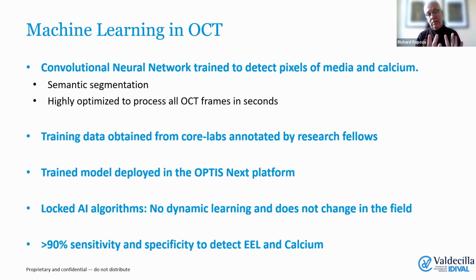This not only involved the AI effort in and of itself and the algorithm that comes out of that, but also optimizing the way we compute all these things so that you don't sit there waiting 10 or 20 seconds for the answer. It comes up in literally 1, 2 or 3 seconds on the screen. Otherwise, the user experience is not good enough. No matter how good the technology is, you can't be sitting there waiting 20 seconds for an answer.